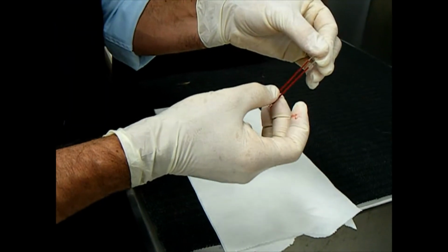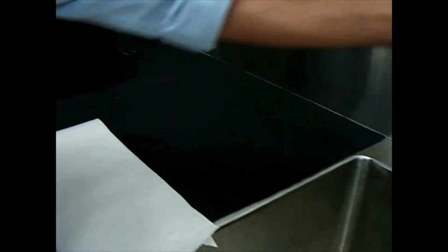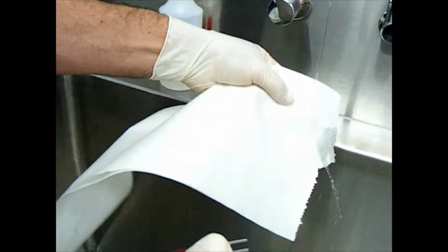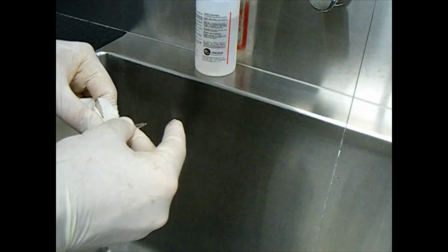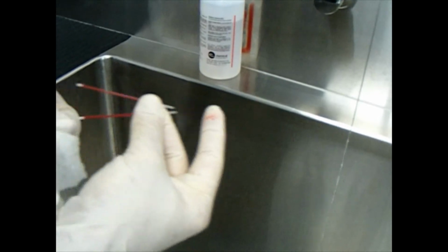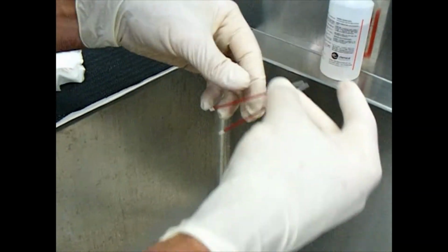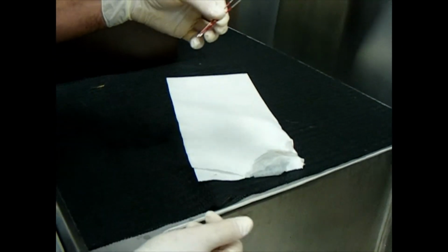So I've got two capillary tubes full of blood here that I've filled up. As I mentioned, cleaning the outside of the tube is always a good idea. So if you just get a bit of water like this and you grab the outsides of your tube, that's always a good way to start. So here are the two tubes, and now we're going to place them in the centrifuge.